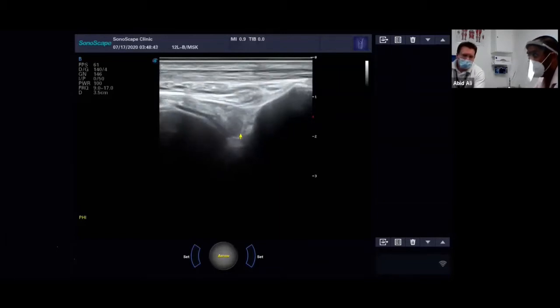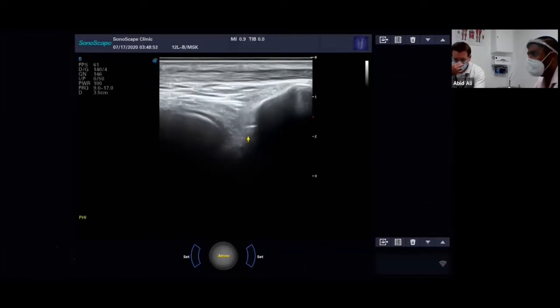Yeah. Also, synovitis in the ankle joint. We saw a case. You saw a case just yesterday, I think, Adrian, of quite an angry ankle. Lots of synovitic changes. So, shall we try and mimic what synovitis would look like in people? I'll just try and move the probe around a little bit.